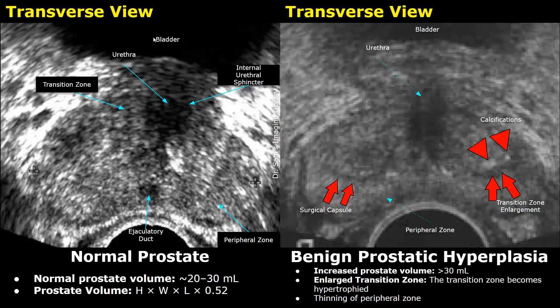In this case of BPH, calcifications are also present in the transition zone. The transition zone is enlarged, and this hypoechoic line between the transition zone and the peripheral zone is the surgical capsule. The peripheral zone appears thin as compared to the peripheral zone in the normal image.